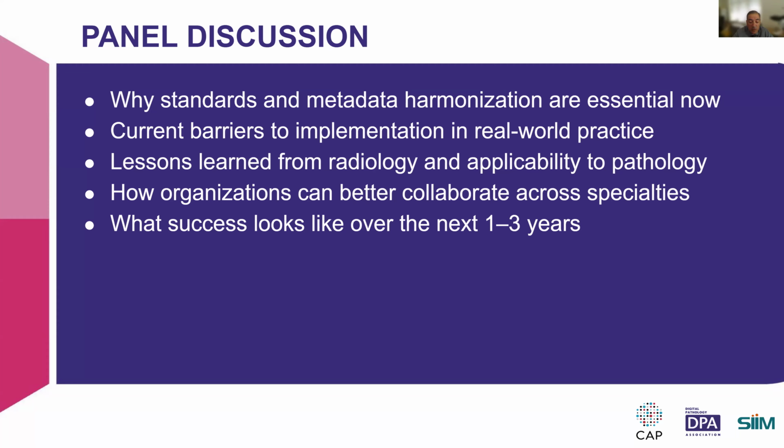Are you supporting all of the required elements? Are you just creating a file with an accession number? So we have image files out there that are being created that only have one identifier. That's certainly not a best practice, right? You want to have two identifiers on all of your assets associated with patients, but which vendors support that? So it's a little deeper than just saying what standards do you support and knowing the name of the standard. And that's where IHE comes in, and I feel that the rest of the world's a little bit ahead of the United States in terms of having IHE as a requirement for vendor selection. But hopefully we'll get there.